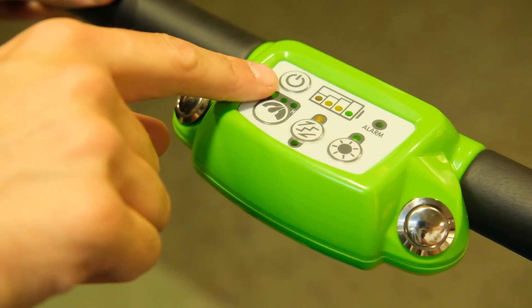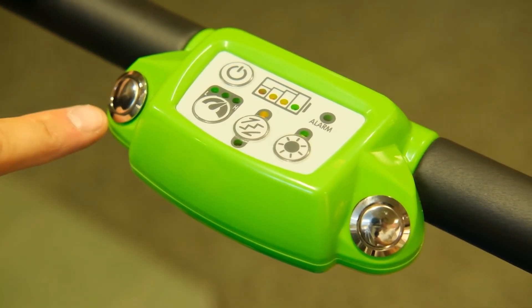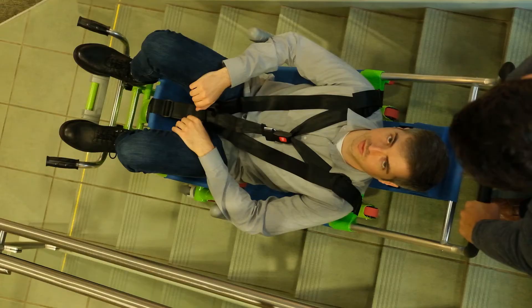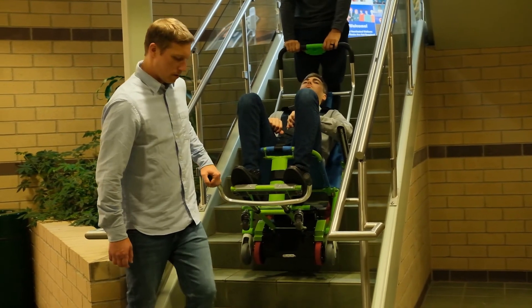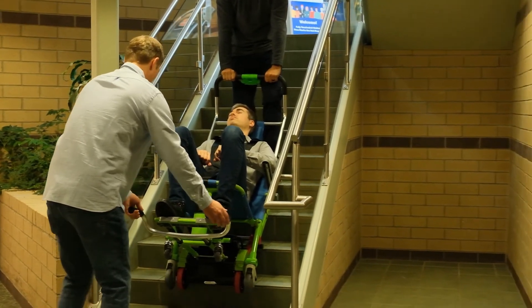Once you are ready to begin descending the stairs, turn the power button on, press the direction button until it is set to descend, and press and hold either of the motor buttons. While descending, ensure the tracks make contact with the second and third stairs and keep downward pressure on the handle as you walk down the stairs. Once you reach a landing, release the motor button to stop the tracks. Return the chair to four wheels and maneuver to the top of the next flight of stairs.